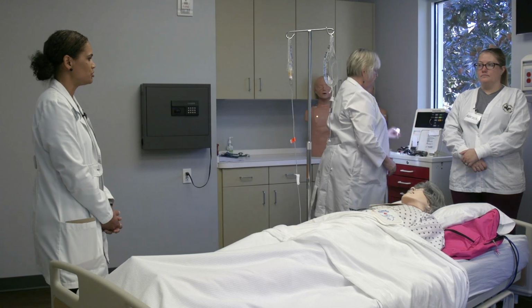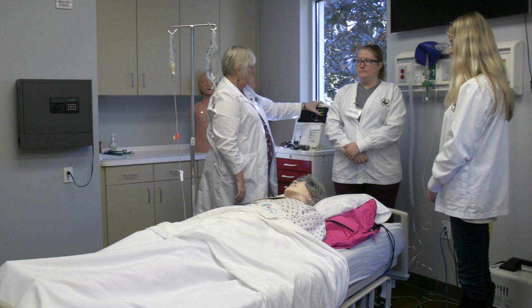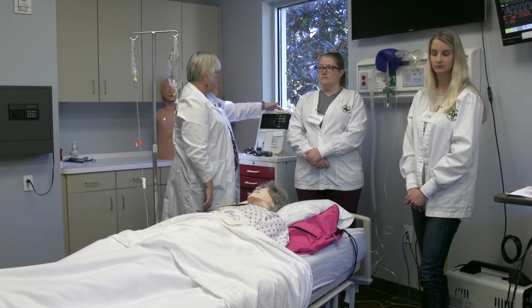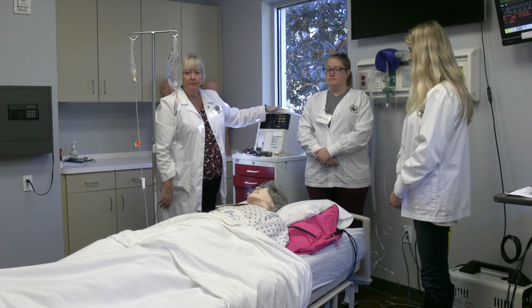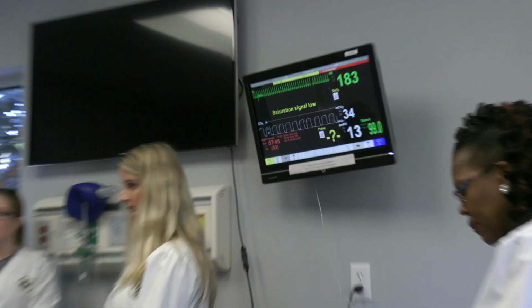If we could change the machine to synchronized cardioversion and deliver a shock. How many joules? 100 joules, please. 100 joules. Ready to shock, all clear. I'm clear, you're clear, we're all clear. Shock delivered. Shock delivered. Has there been any change in the patient?